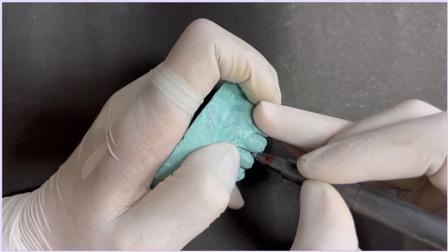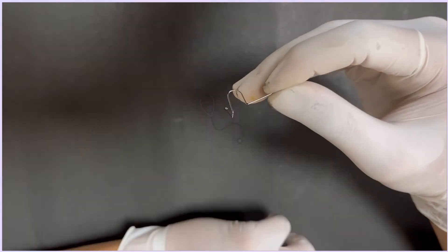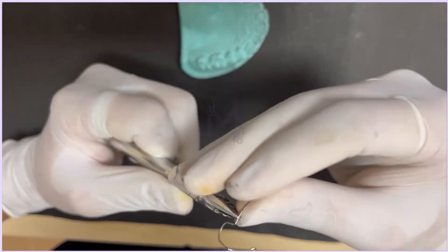Mark a point on the active arm slightly below the contact point between the first premolar and the canine. Bend this wire at a right angle so that it rests on the buccal surface of the canine. Adapt this active arm to the canine by using the universal plier.